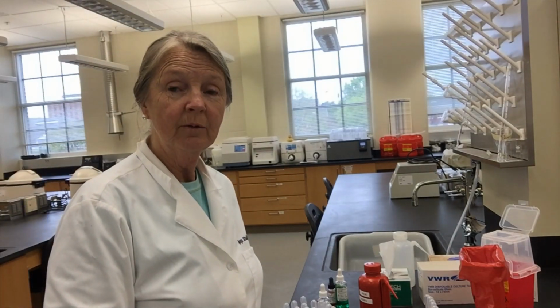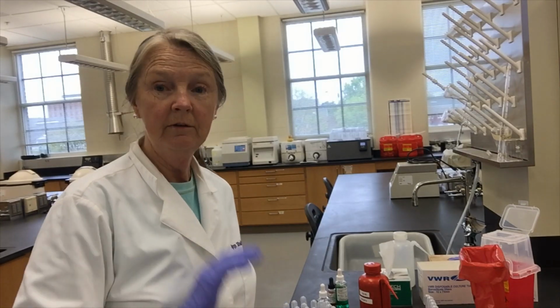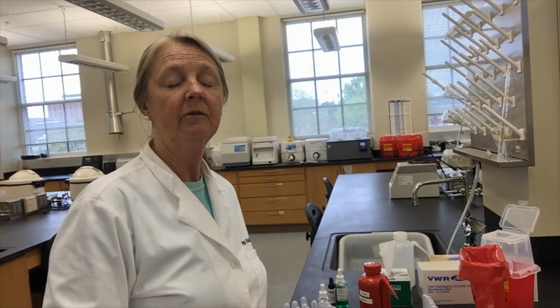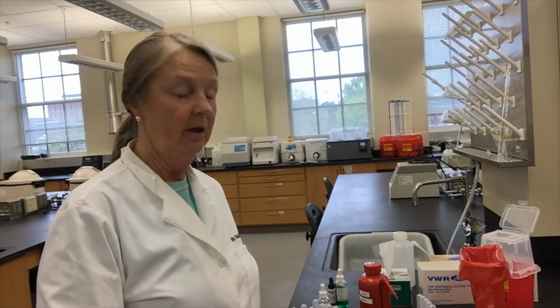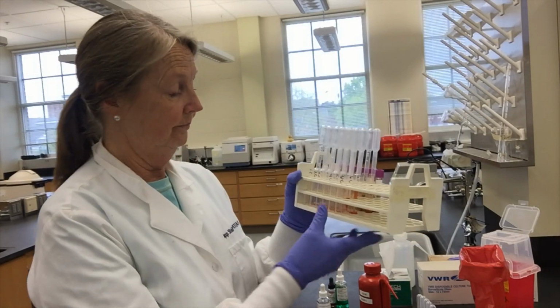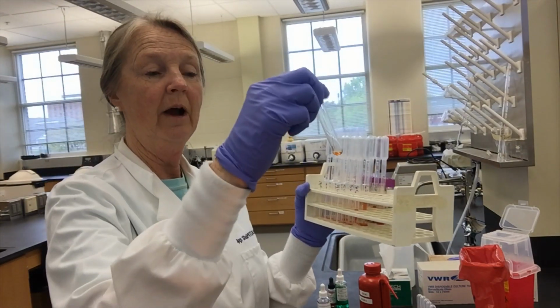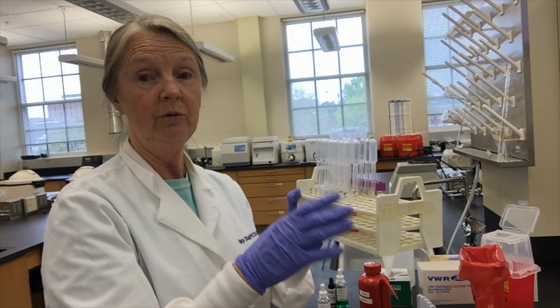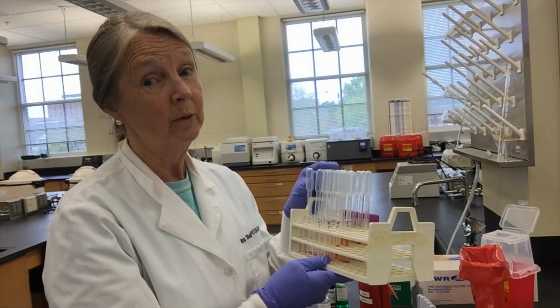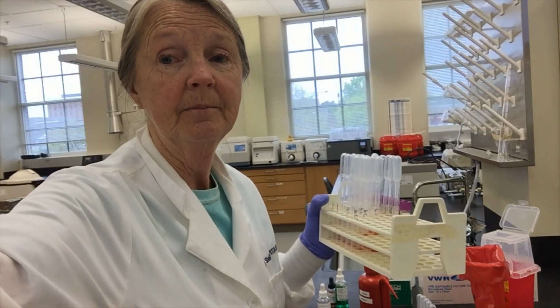Now we're doing the indirect antiglobulin test, or the IAT. You will use this next week for antibody screens and identification. We are looking for antibody in our serum. So I have taken the serum, I've placed 2 drops into each tube. I've given you 6 samples, and now I'm going to place 1 drop of red cells into each tube, and then we'll do an immediate spin.